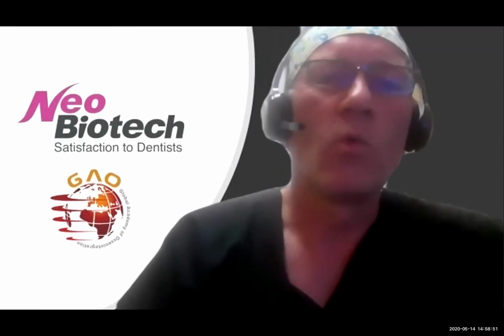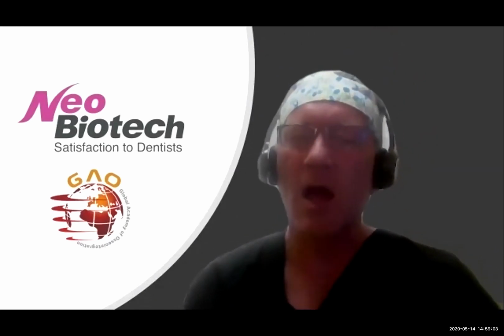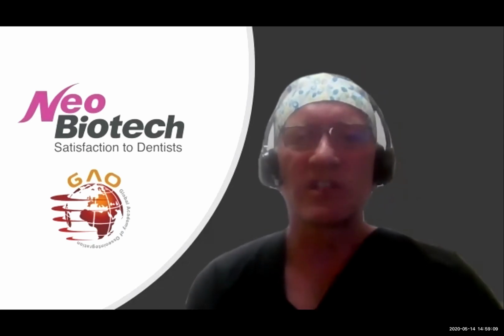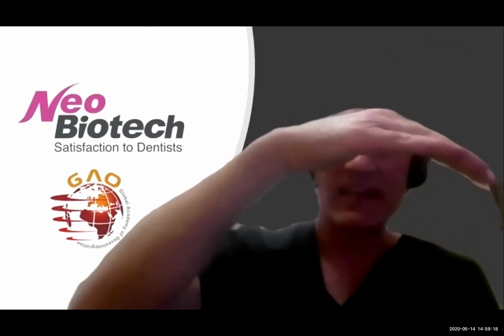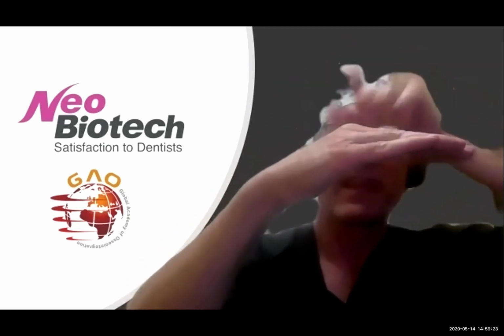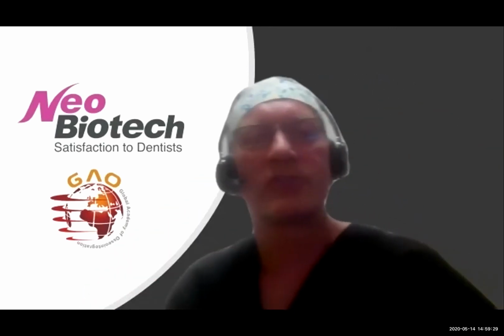And let's see what we have here. Our first one is for root coverage and flattening the buccal surface. What are the risks of causing a root canal? Thank you very much for that. I did not go deep enough into that. When I'm flattening the root surface, I do not want to extend that into or close to the nerve space. Essentially, if I have a root that is curved, I want to flatten or level that off a little bit. I'm still wanting to keep the architecture there, but if it's a large curvature, I want to flatten it just a little bit. I'm not flattening the root surface completely. Thank you for that question.